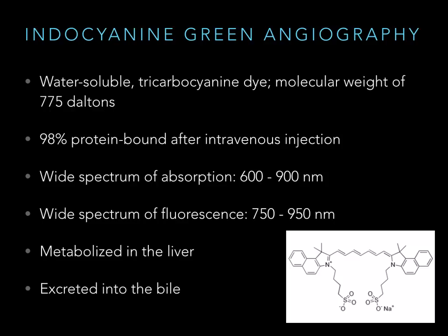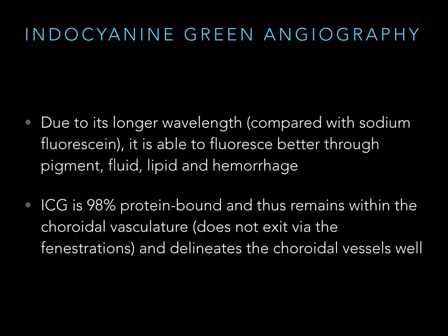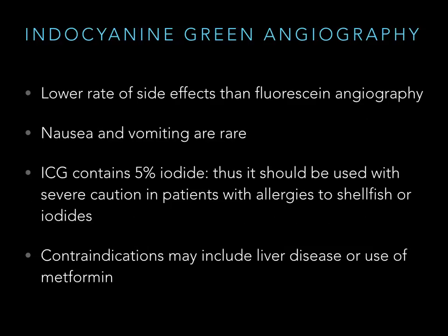Okay, ICG, you only got a few minutes. What do you need to know about it? It's got a wider spectrum of absorption and fluorescence. It's almost all protein-bound, and the protein-bound portion fluoresces. Here's a more important slide. It's got a longer wavelength. It fluoresces through the RPE. It does not exit through the fenestrations of the choroid. Those two things, if you remember nothing else.